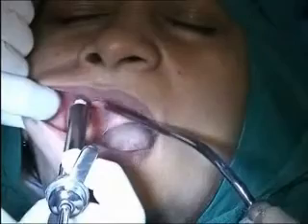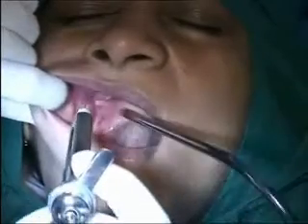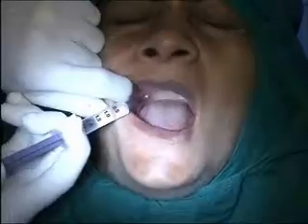Right in the tuberosity area. Now, remove that side. I have given the infiltration. The palate injection always pains a little bit.